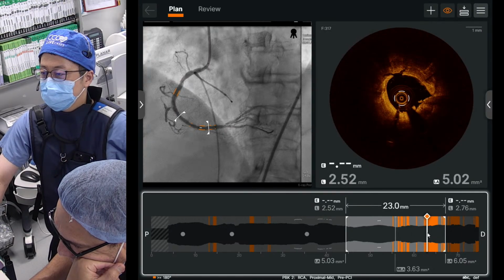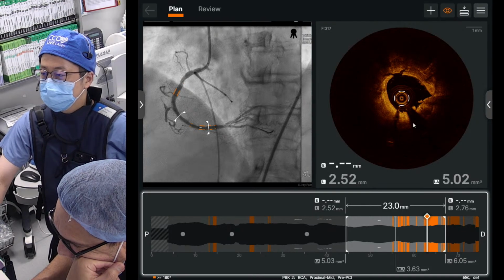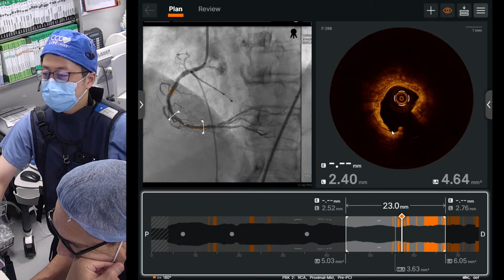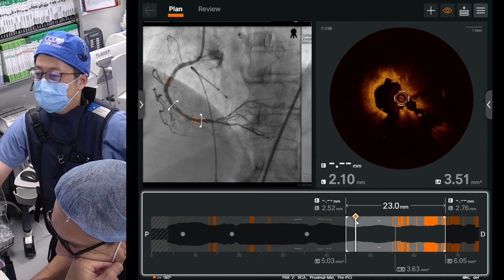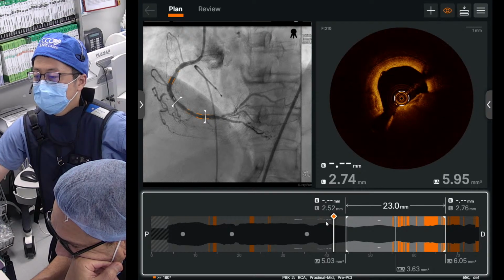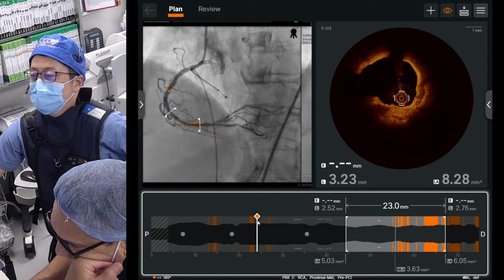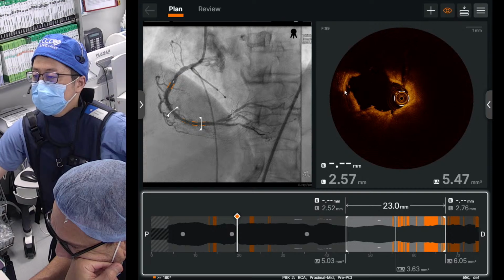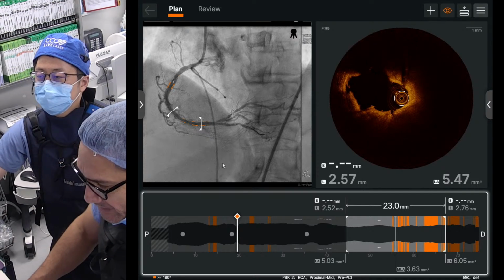Let us see, start from the distal. Or I see 4.5? Some small calcium fractions here, like 11 o'clock. Yes. This is post IVL. Yeah, here also some calcium fracture or some dissection. But anyway, let's call it fracture. Yeah, anyway, it's a good plaque modification. It's a healthy problem. That means we will have a good, bigger stent lumen area expansion. Yes, multiple calcium fractures here and here and here, like 3 calcium fractures at our tightest spot.